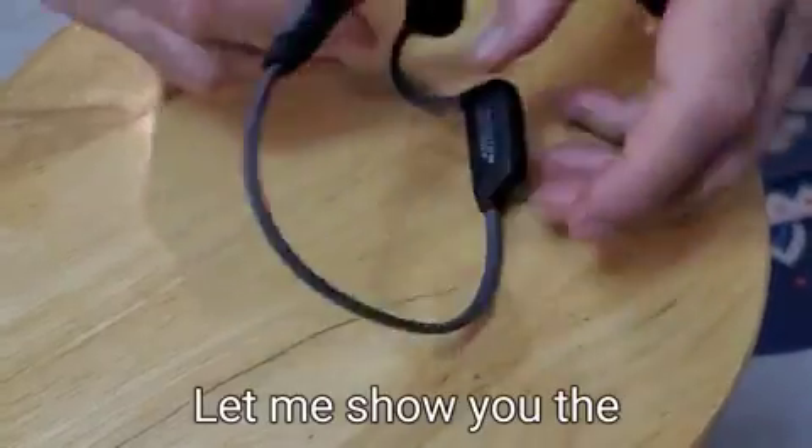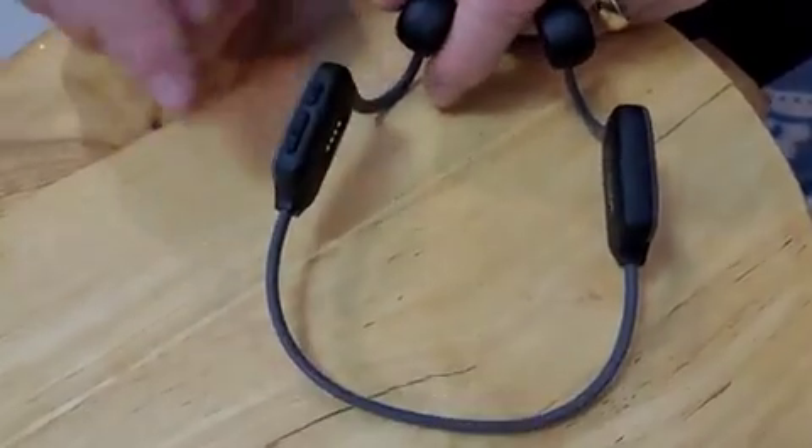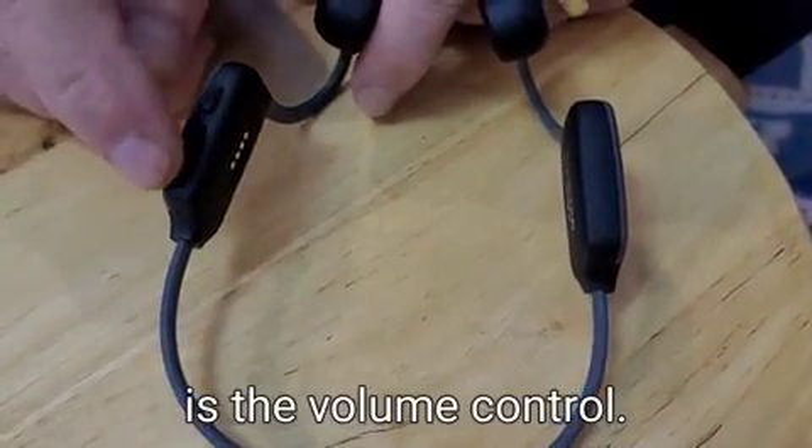Now let me show you the different buttons and functionality. This button is called multi-function and this is the volume control.